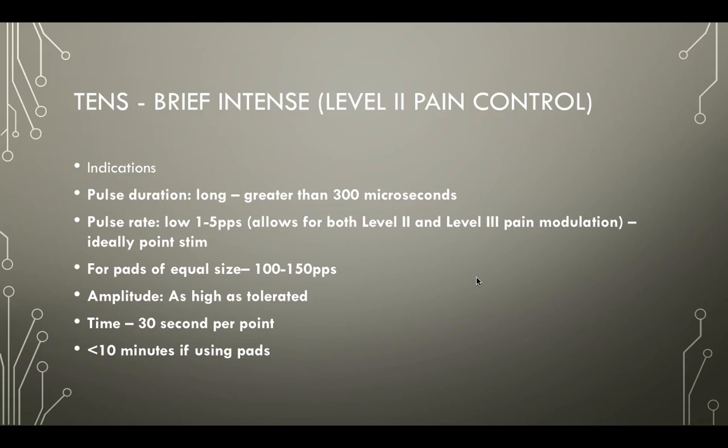Again, here's the kicker. We don't necessarily get muscle contractions, but we could. There's some debate if we can use it acutely, though if someone's in an acute inflammatory condition, they're probably already kind of weary, and to cause them more pain is maybe not the best option. So we could use our level 1 for that. So again, it tends to end up being more subacute chronic situations.